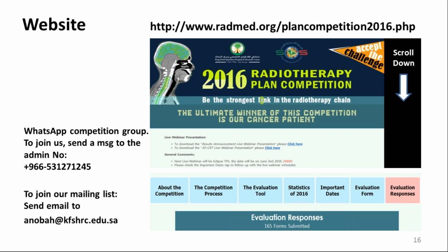So what happened is that we collected all these feedbacks, and we improved our next competition workflow, I would say. We included all the feedback of the planners who submitted the evaluation forms into our next competition.